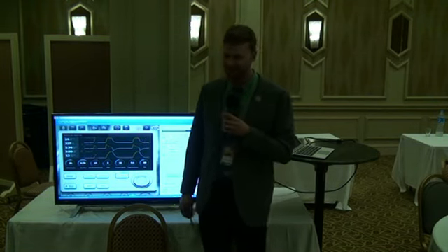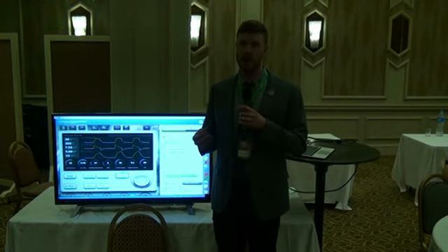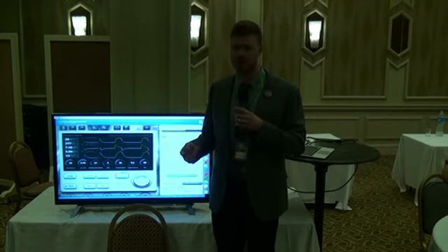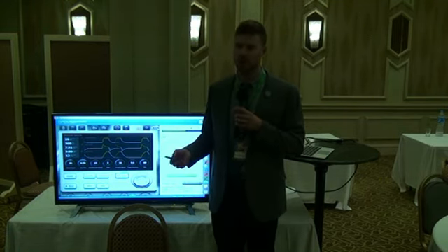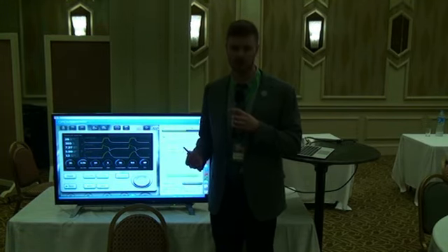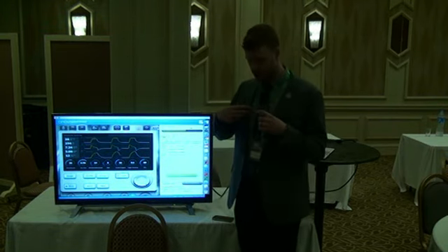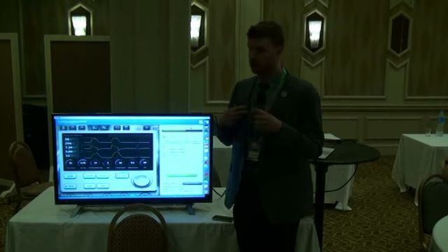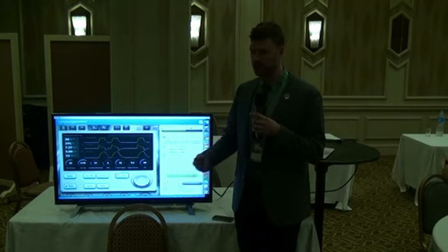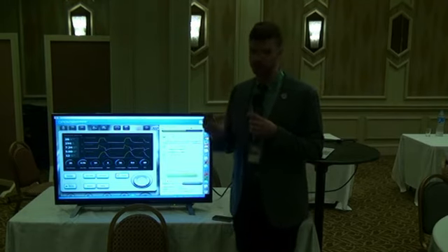The different devices will also be device dependent on how often you have to recalibrate. The longer that you can go in between recalibrations, obviously the better, but you don't want to go so long that you have introduced error in your device and you're not even measuring the correct CO2. It's also perfusion dependent, so you have to pay attention to the perfusion of the subject. The sites that we'll choose are on the thorax, central to the body. When you start to get sick, you may constrict some peripheral vessels, but placing the probe near the chest or on the chest is the best place to do it.